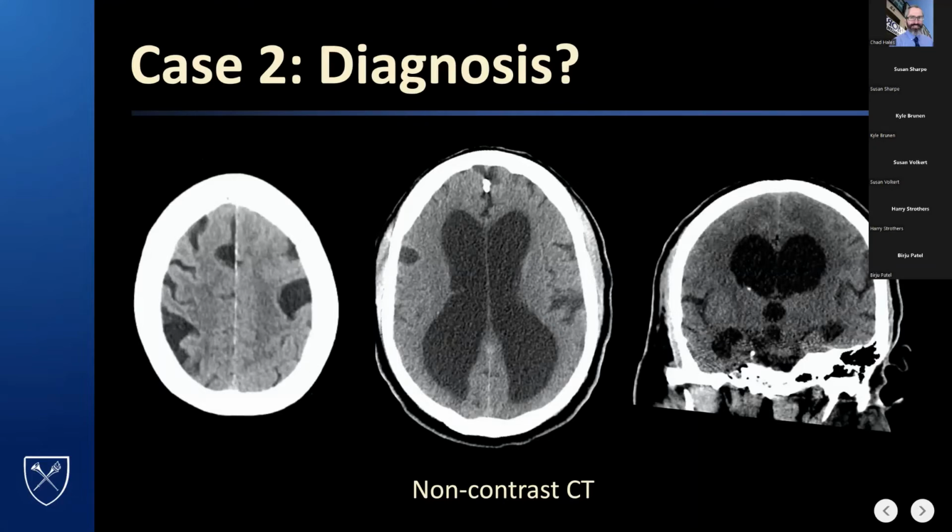The fact of the matter is that in normal aging or due to a variety of neurodegenerative conditions, the ventricles can get big. And most of the time that is on an ex vacuo basis. That means the brain around it degenerates and the ventricles get big. And so it can sometimes be a gray area, and that's when we're not so sure whether we're dealing with just atrophy and enlargement of the ventricles or hydrocephalus.